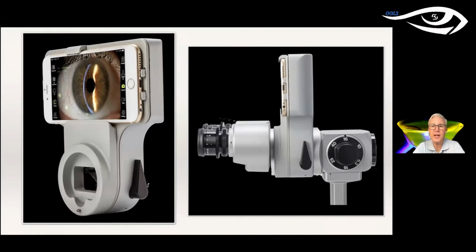Really, anterior segment pictures are really good if you have a lot of blepharitis or Demodex. We have this in the United States. I'm not sure about Asia, but we have a lot of the mites that infect the lids. And if you're trying to convince one of your patients to clean their lids, or the need for you to clean them, it's great to capture that and show them in a large image, and it gets their attention.